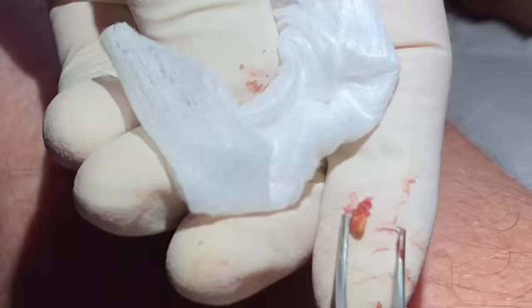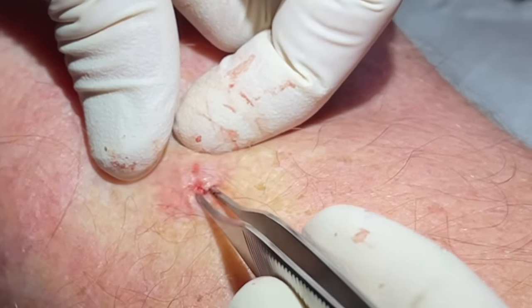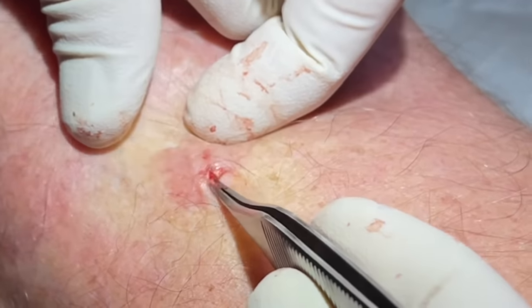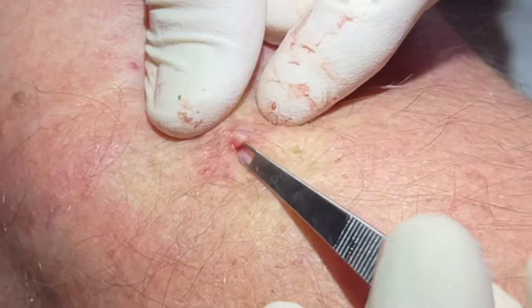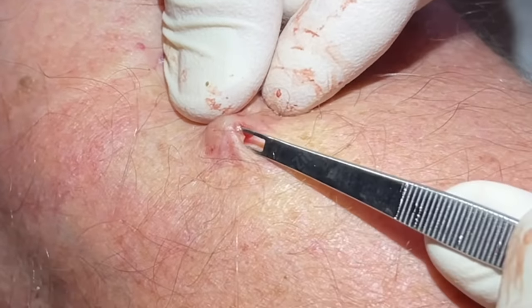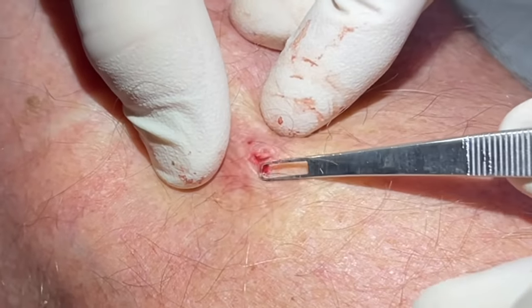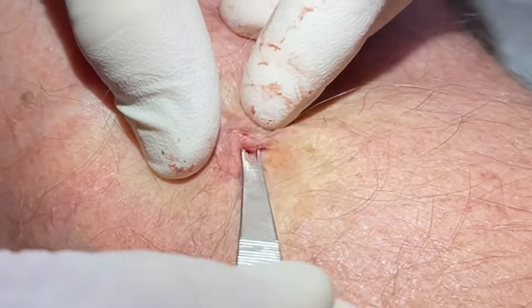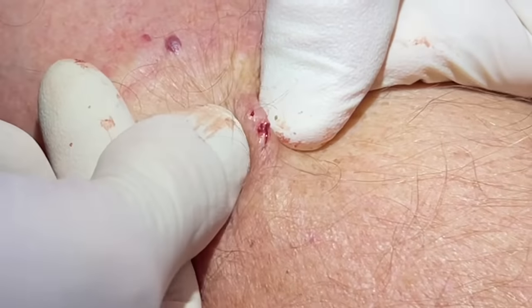We can look down in there. That looks like the bottom of the pore — we got the last bit out. Sometimes I'll take an extractor and go into that pocket and really scoop under the skin there, to make sure nothing is tracing out to the left or right. It doesn't look like it — just a dilated pore, kind of an open pore in there.